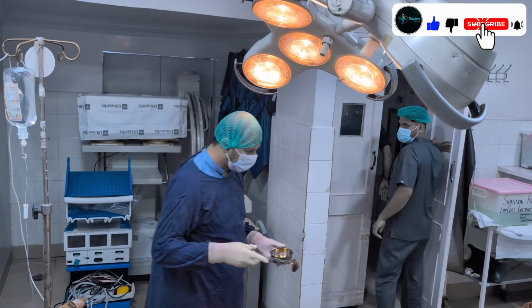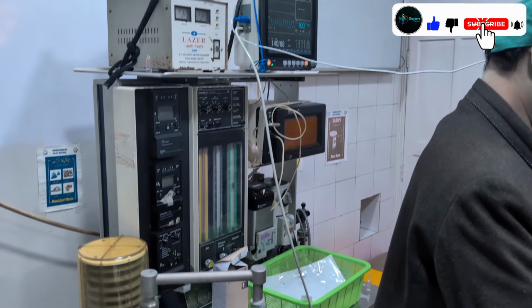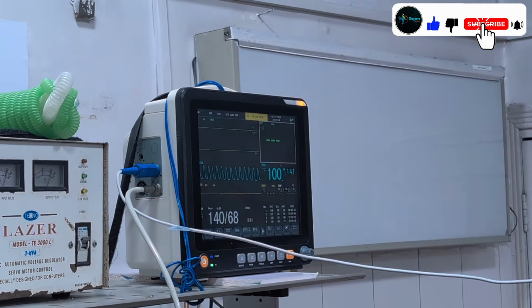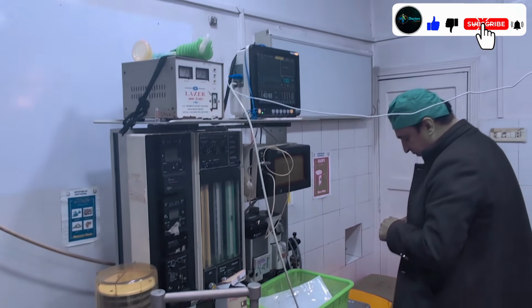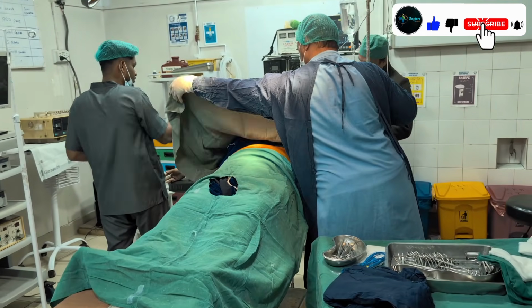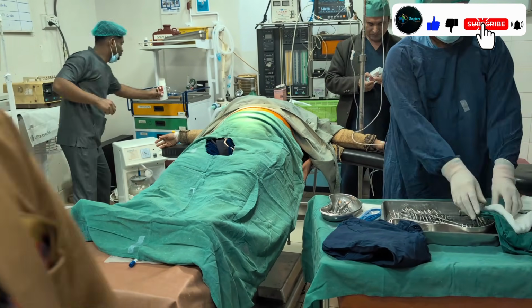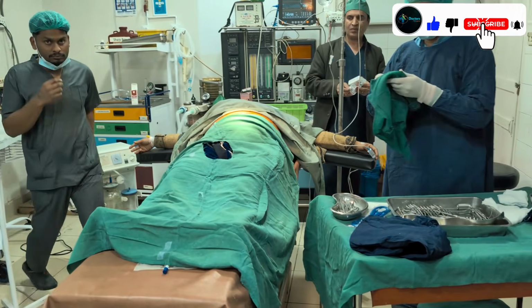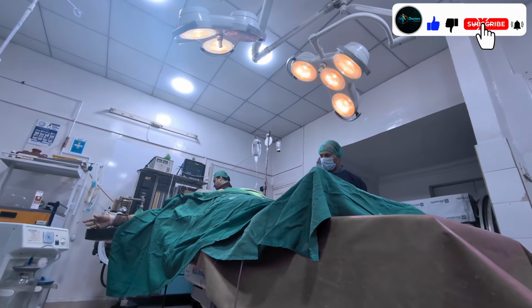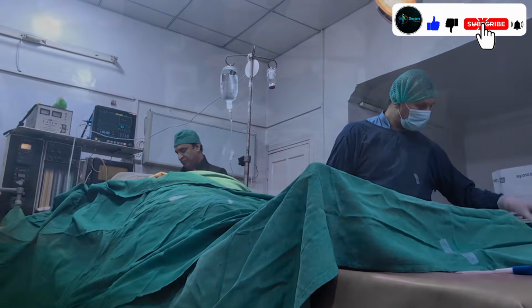This is our cardiac monitor, an anesthesia monitor for patient monitoring. This is the ventilator in front of you, as you can see. The doctor assistant and surgical staff are doing the toweling. The patient has been covered properly. The towels are being placed from one side to the other. This is a scene of our operating theater.